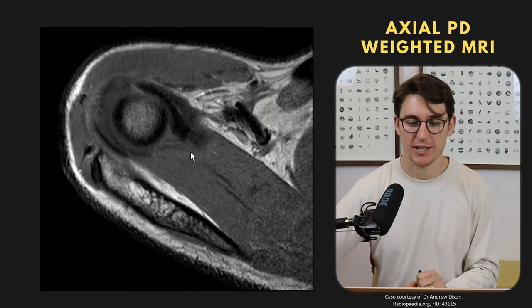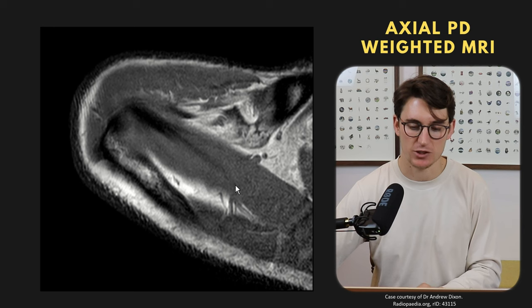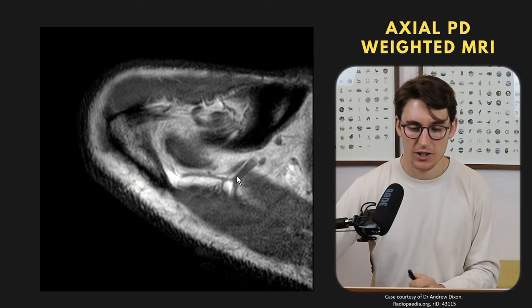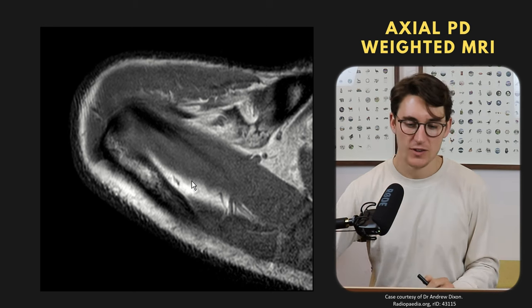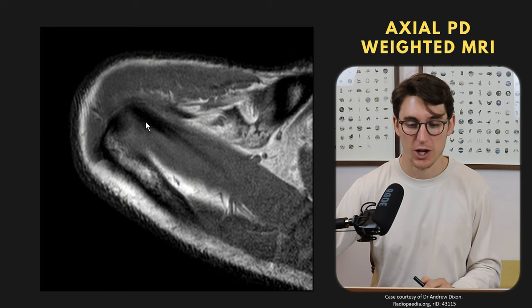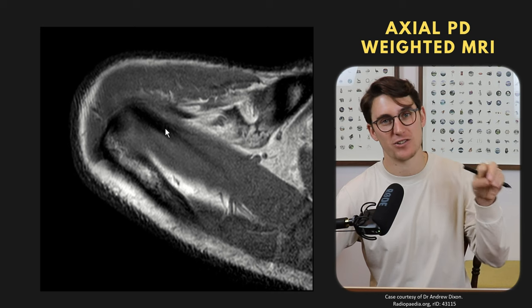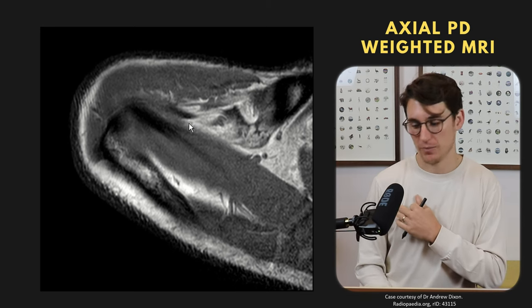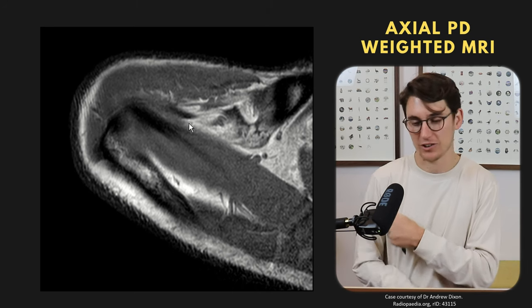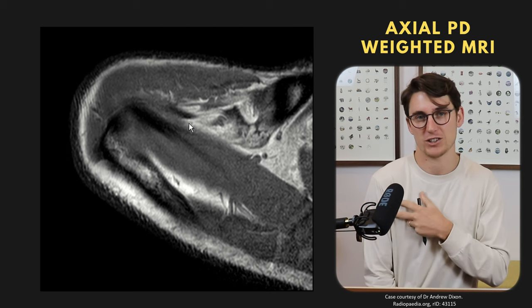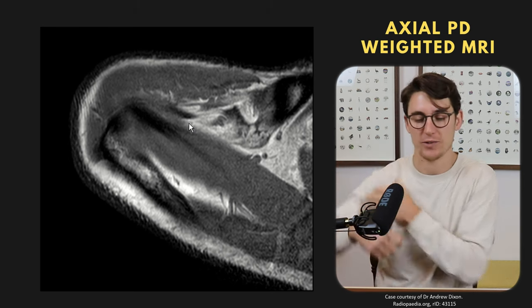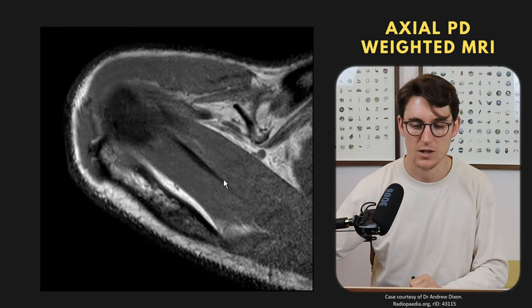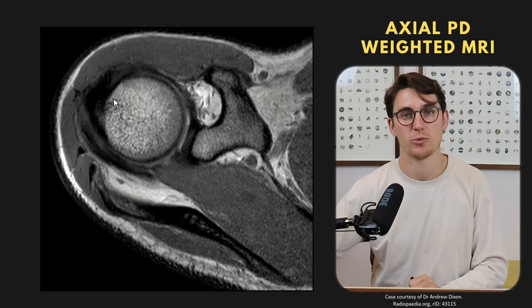Finally looking at the muscles on the axial slice — this is why we start axially, because we use this view to set our coronal and sagittal planes perpendicular to the supraspinatus tendon. Coming to the top of the scan, we can see the supraspinatus tendon going over the head of the humerus to attach to the superior part of the greater tuberosity. We look at the muscle bulk — a non-functioning supraspinatus means patients will struggle with the first 15 degrees of abduction, since the deltoid lacks mechanical advantage until the supraspinatus lifts the arm out slightly. The tendon should be nice and dark with no bright patches.